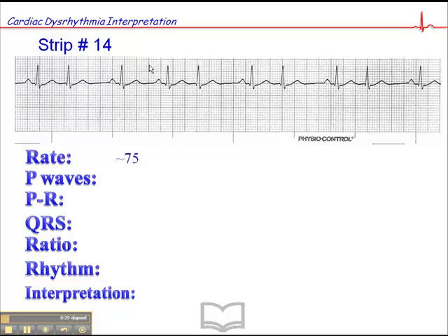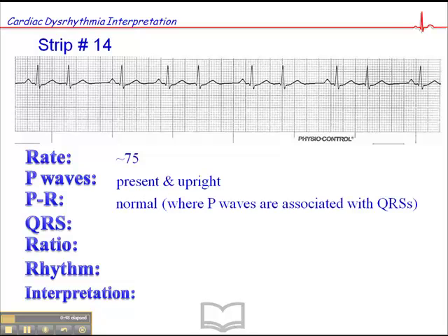Or you can try to find the underlying rhythm, where we have P-waves, QRS, P-wave, QRS, and measure the heart rate based on the distance between two sinus beats. P-waves are present and upright in the underlying rhythm. The PR interval where P-waves are associated with QRS is normal. The QRSs are all narrow, less than 0.12 second. The ratio where there are P-waves associated with QRSs is one-to-one, and the rhythm is irregular.